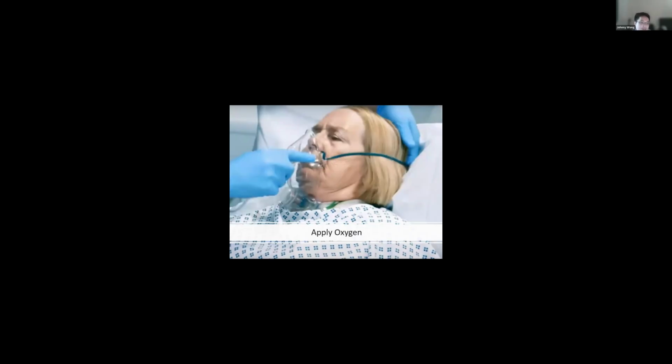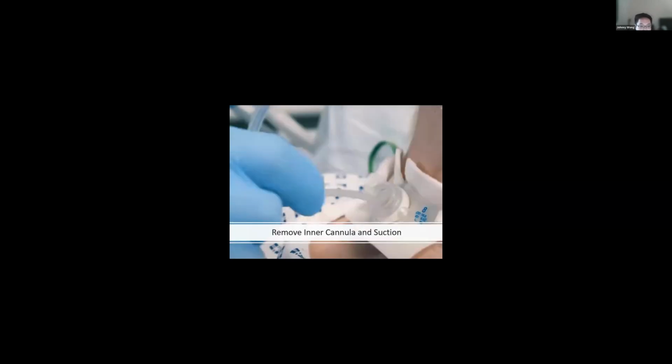And then after that, if you apply oxygen and they're still not sounding too well, still in respiratory distress, the next step is to remove the inner cannula and try to suction. This is both diagnostic as well as therapeutic. If you push the suction through and it goes through smoothly, there's no obstruction.